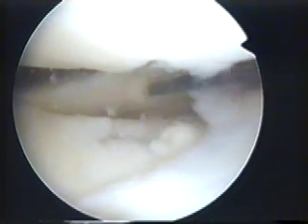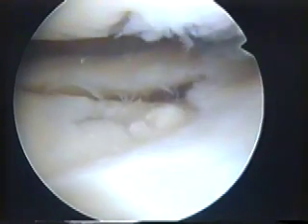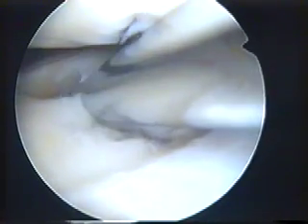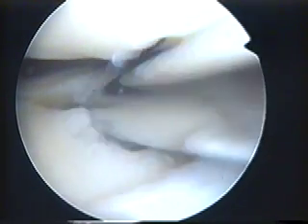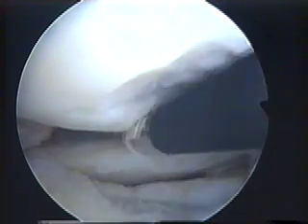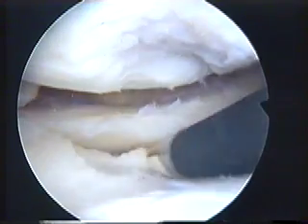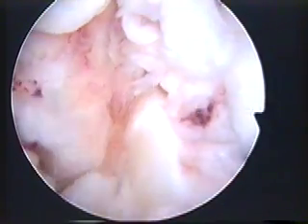There's the outer bearing of the knee. The top of the tibia in the lower part of the picture is damaged, as is the lower end of the femur. I'm using the shaver just to trim back the damaged tissue. This is surface damage but in the centre there it's virtually down to bone. Now I'm sealing the surface with the diathermy. So there is quite significant damage here in the outer bearing of the knee.